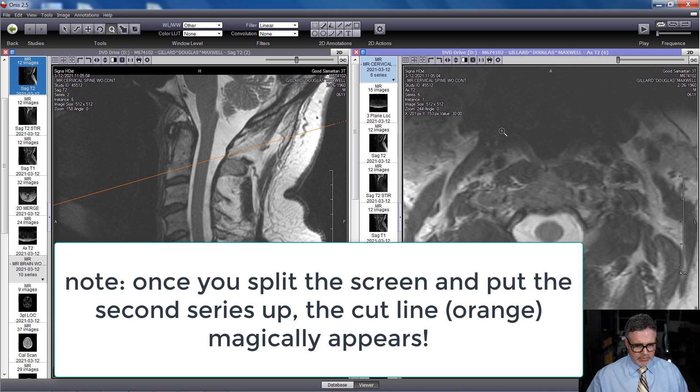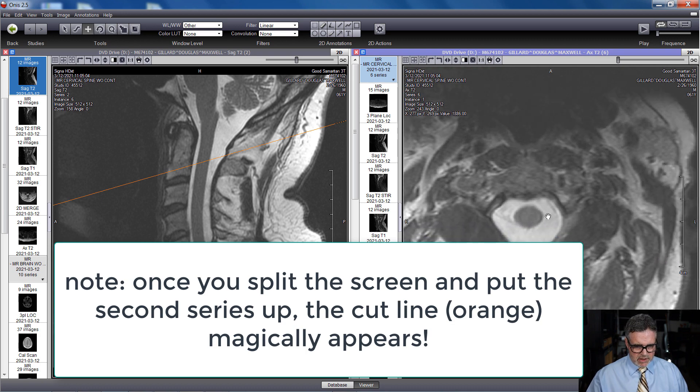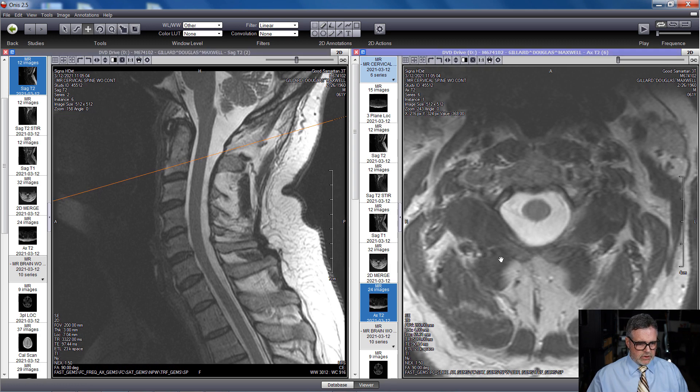Let me use the magnifying glass to blow this up. How do you know it's a T2-weighted image? The cerebrospinal fluid glows white — anything with water appears white, including swelling and inflammation. So this is definitely T2-weighted. We can see the spinal cord right there. Now I want to see every cut in the series. Starting at instance one means we're at the very top.